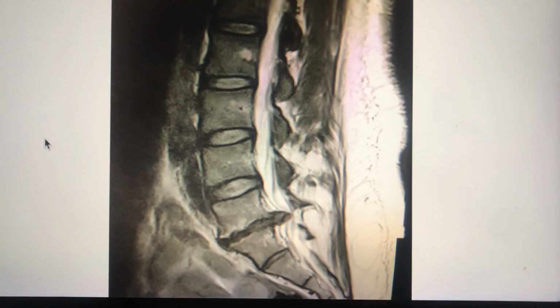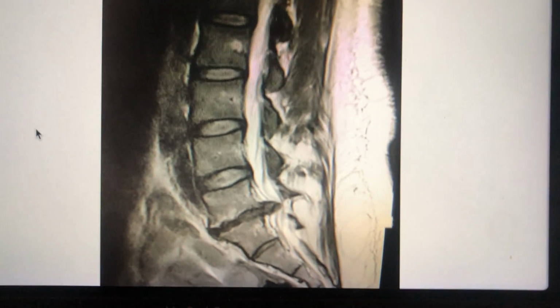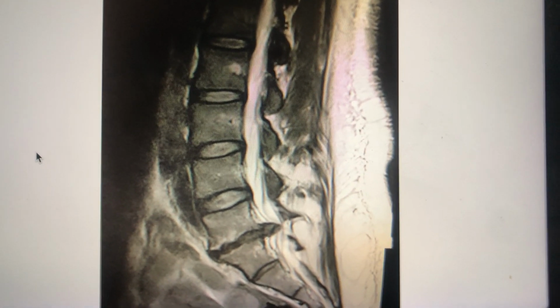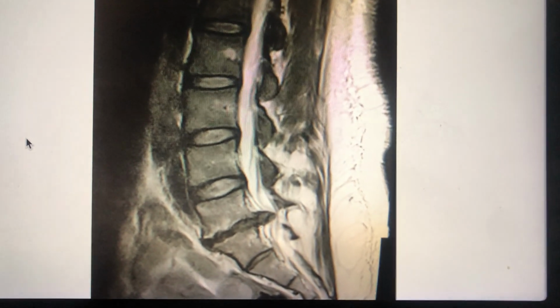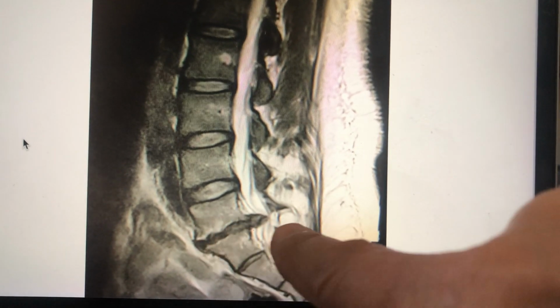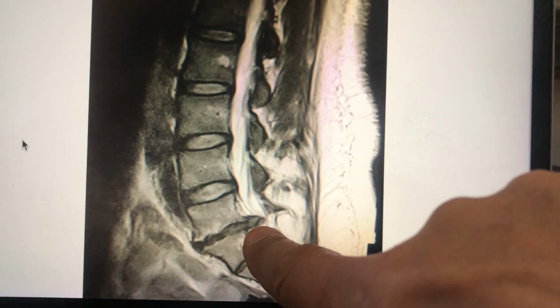All right, this is Dr. Castanet. I'm off camera again. This time I'm going to show you a low back MRI scan, or lumbar MRI scan, with a herniated disc. It's pretty apparent to anybody that looks at it, even a lay person. You can see the disc is sticking out right there.